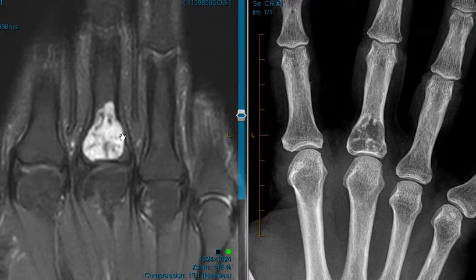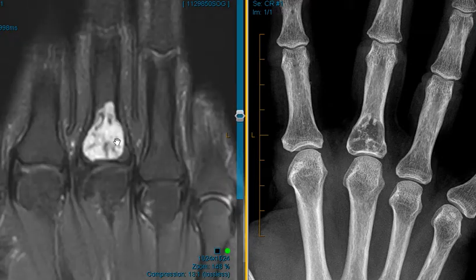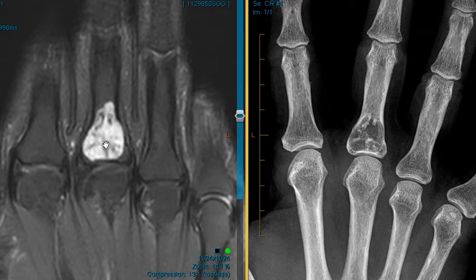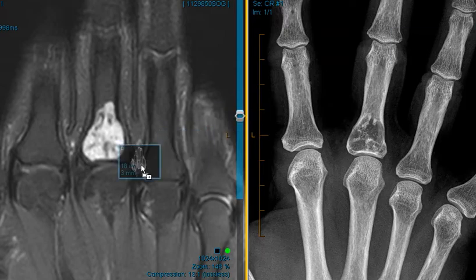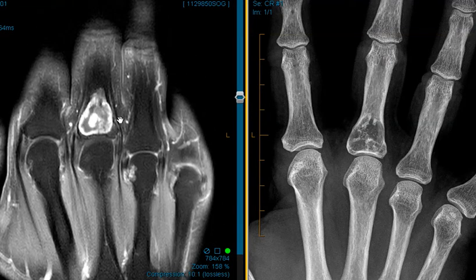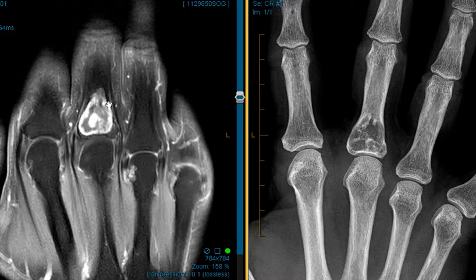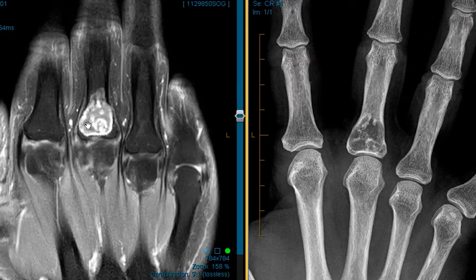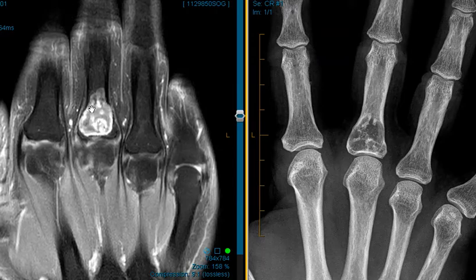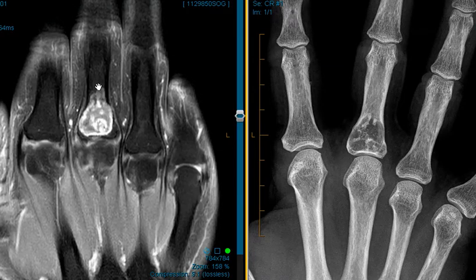The margins are really sharply defined, which is a sign of a benign lesion. You can see these little dark bands — those are areas of bone density within it. On the post-contrast image with IV contrast, there are some areas of patchy enhancement within it, but the margins are very well defined. There's endosteal scalloping, no pathologic fracture, and it's not really expanding.